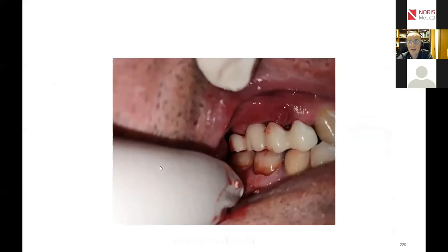So actually, I answered all the questions. And if you don't have any more, here I have. When we grind the abutment, what is the best way for impression and then pure that? Yes, when we grind the abutment, the best way of impression that I knew, let's say till a year ago, is only to do a putty and wash. Sometimes alginate worked very good for me for temporaries, of course. For the fixed crowns, of course, only putty wash.